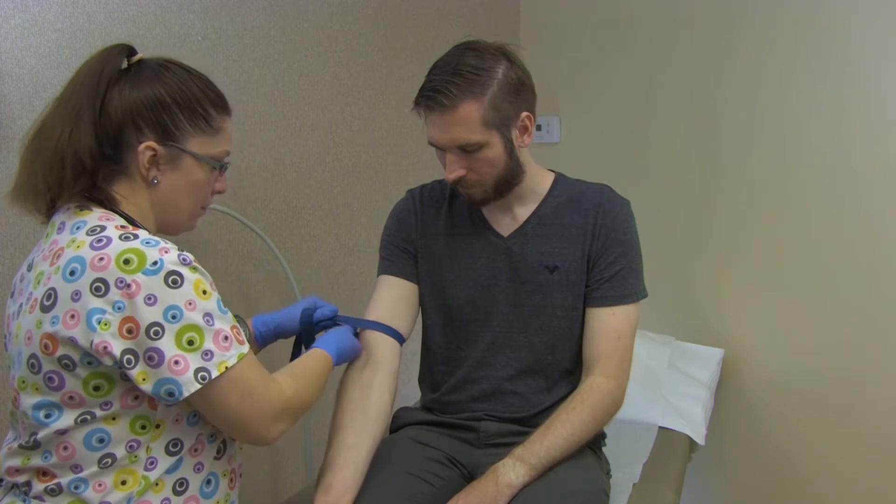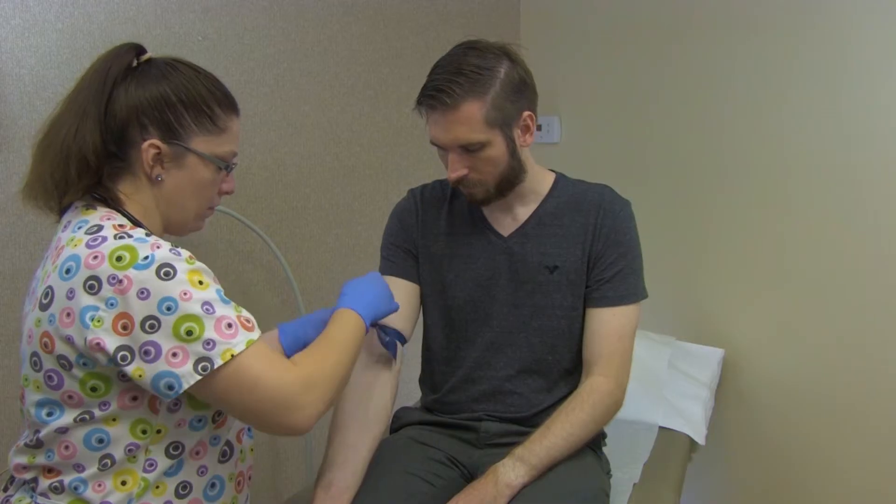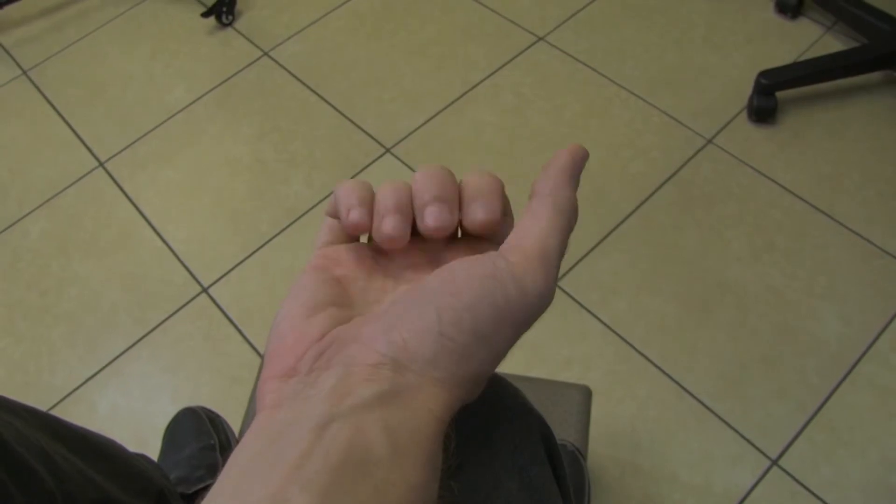Apply the tourniquet two to three inches above the venopuncture site, usually the antecubital space at the crook of the elbow. Apply tightly enough to slow venous blood flow, but not so tight that the blood flow in the arteries is stopped. Have the patient close their hand and place their arm in a downward angle. Do not have them pump their hand.